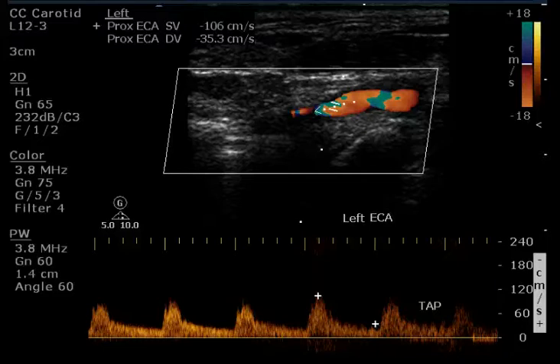The left side contains a stent in the ICA, and the stent is widely patent without evidence of clinically significant disease. There is mild plaque in the distal ICA, and the level of this stenosis is between 1 and 50%. There is also plaque within the ECA on the left side.